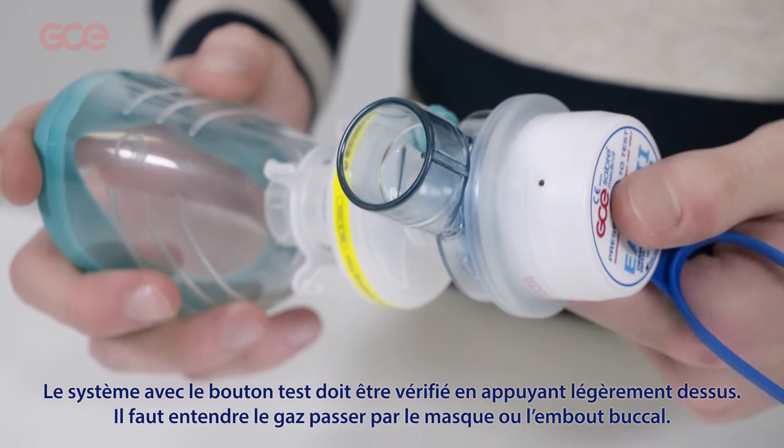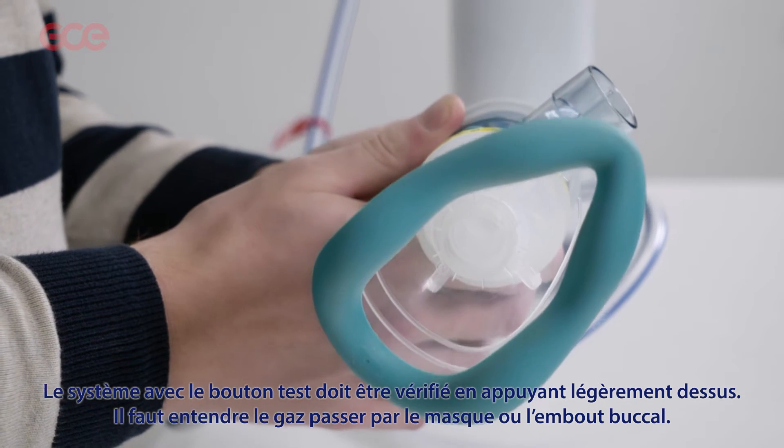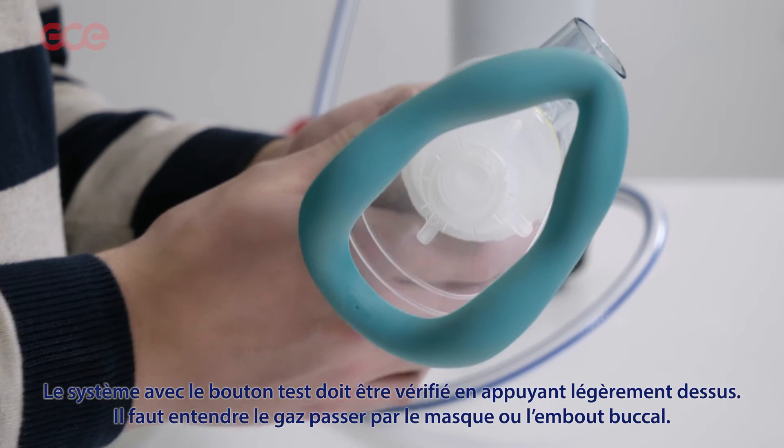Units should be checked by lightly pressing the test button. Gas should be heard flowing through the mask or mouthpiece.